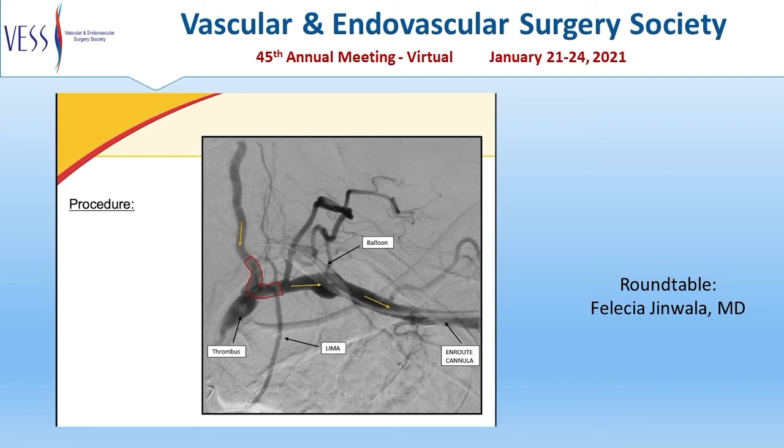The axillary artery was then clamped distal to the sheath to control for outflow. The bypass itself was occluded using a 9x20 Mustang balloon, as depicted here in the image by the black arrow. An 014 wire was used to cannulate the left vertebral artery, and 2 open cell stents were deployed to transpose the origin of the vertebral artery endovascularly, which is demonstrated here by outlining in red.